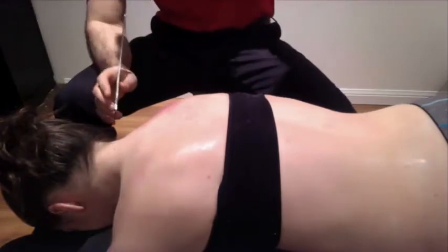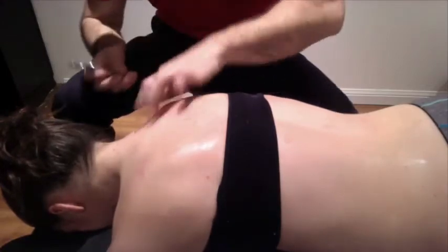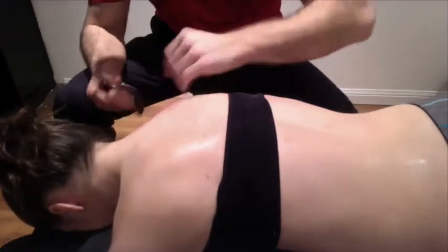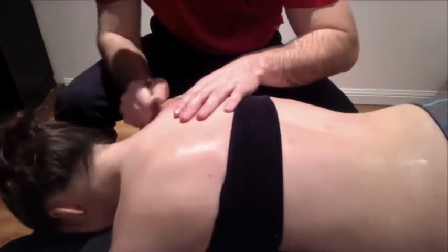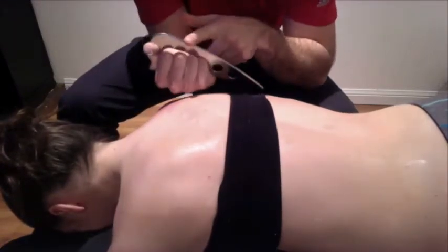Now, if you've seen any of our previous videos, we've shown a couple of different ways to kind of attack the traps. So we're going to take this and instead of pulling outwards like you would doing hands-on soft tissue, we're going to work the traps inwards up towards her neck. Just short little strokes, and now I'm starting to use the number two edge on this side.